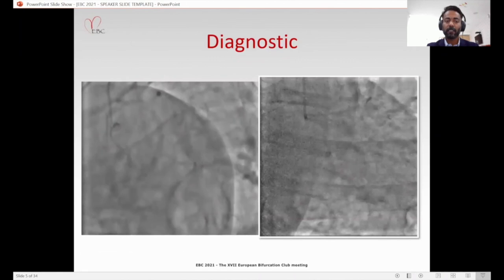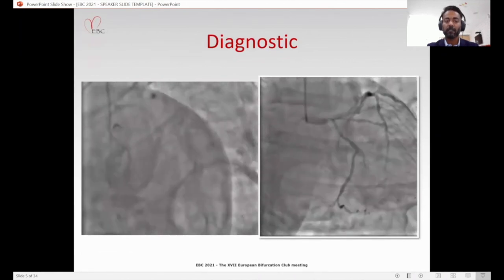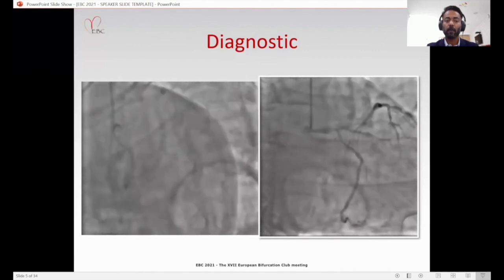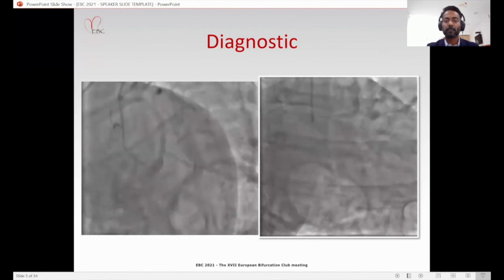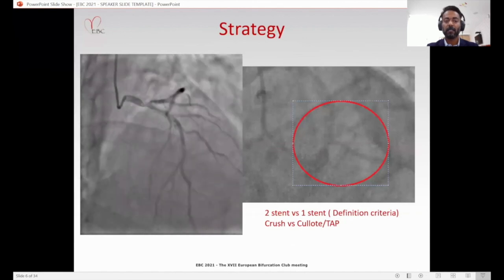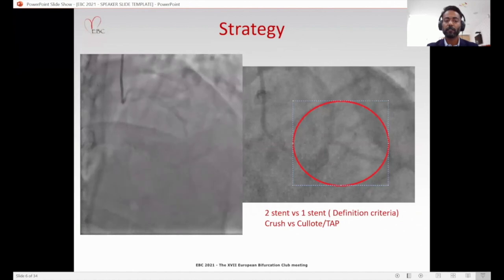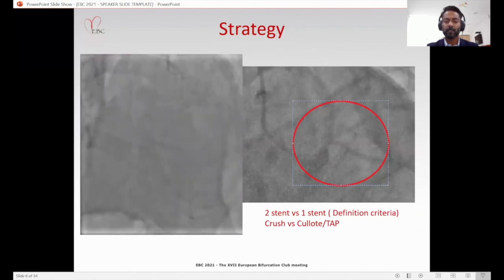In the spider projection, we appreciate an eccentric lesion of the circumflex, which had a tight ostial lesion and diffuse disease, about 70 to 80%, extending beyond 20 millimeters into the circumflex body. So the patient had calcified left main triple vessel disease and was discussed in the heart team meeting for the best treatment strategy. Considering his age, he was refused for CABG and was planned for a PCI strategy.